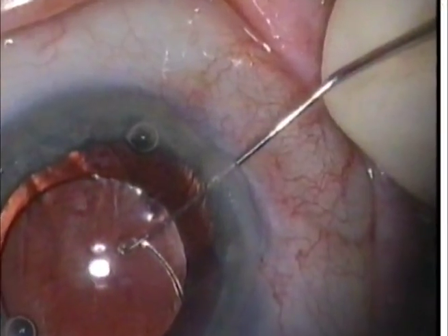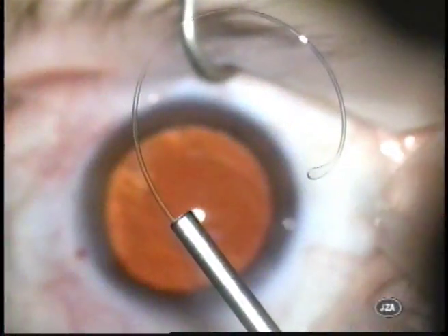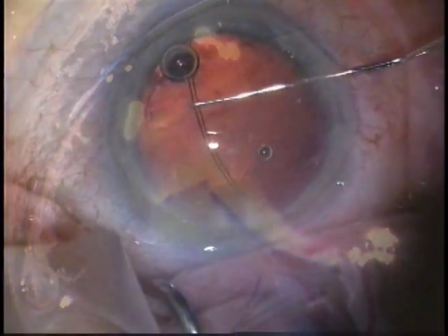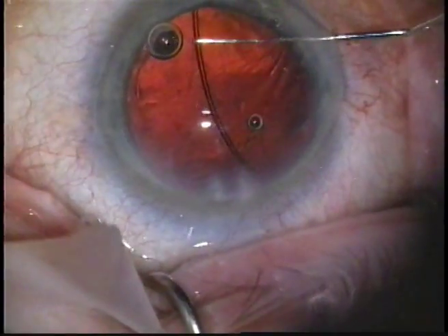While using any of the current methods for insertion of capsular tension rings, some observations can be made. There is an initial point of contact between the leading portion of the ring and the inner equatorial wall of the lens capsule. Sometimes the angle of this contact may be steep enough to damage a weak capsule. Equatorial rupture of the capsular bag during this maneuver may mean inadvertent implantation of the capsular ring into the vitreous cavity, with or without damage to the peripheral retina.